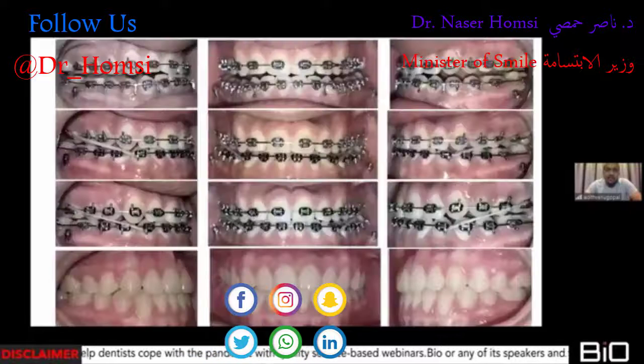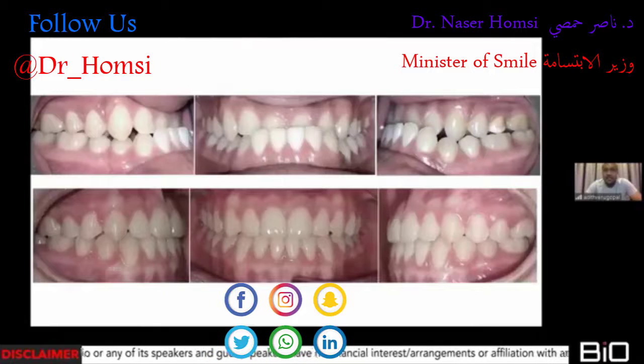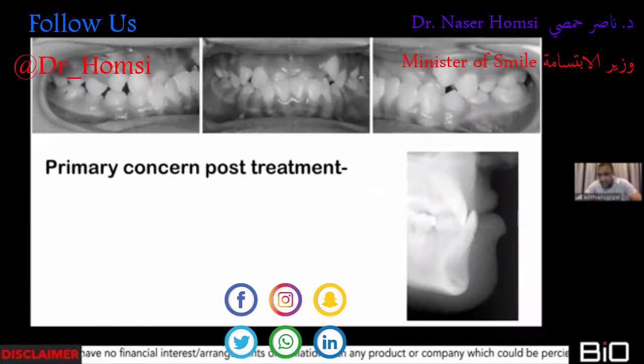And so you can see over here that from a progression of a very deep curve, I was able to upright the lower incisors and get a good finish on this case. So starting from here, I ended up with upright incisors and a decent finish on this particular class 3. This was not a very easy case, but if managed well, I've done that with conventional brackets.